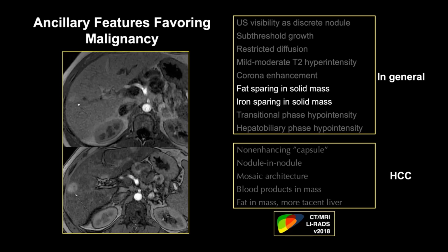In this example, there is diffuse hepatic steatosis, and the focal observation spares the steatotic change, as you can see in this opposed phase image on the lower half of the screen. When there is diffuse abnormality of the liver, it provides an additional opportunity to detect those focal hepatic observations. So use those to your advantage.